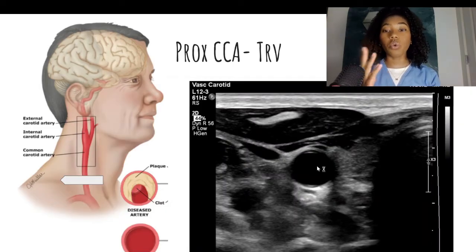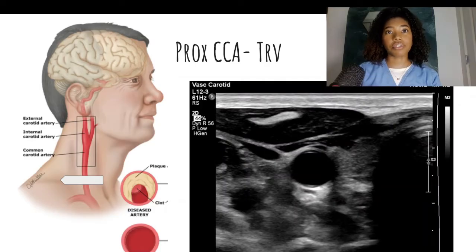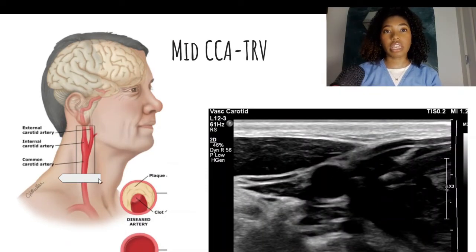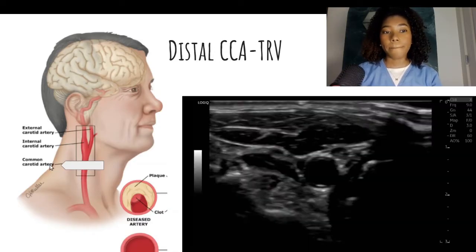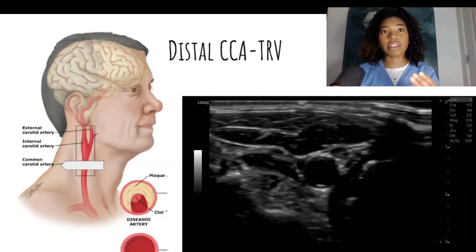You can take your image here or do a cine loop depending on what your facility requires. To do that cine loop, you would scan from inferior to superior — make sure you include the bifurcation and any plaque in the bulb — then scan back inferior. Next, we will move superiorly on the neck to image the mid-common carotid artery, then move more superiorly to image the distal common carotid artery. It should still be looking round. I usually scan up to the carotid bulb where the vessel appears as an oval, then back inferiorly to where it appears as a circle again.